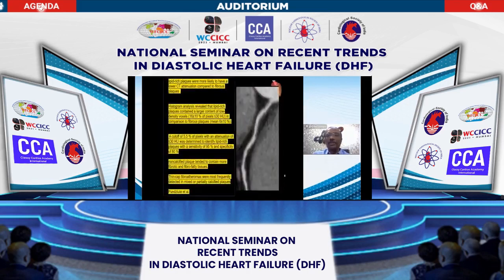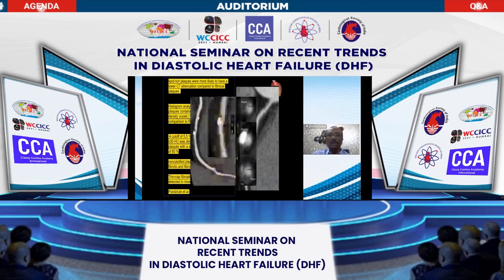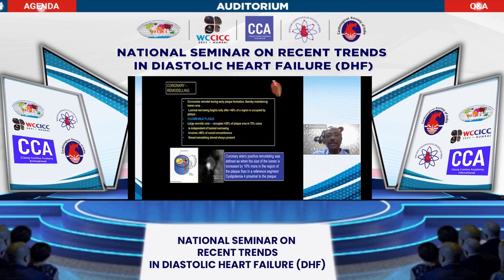So this is one clinical example where we have done a curved planar reformat showing mild to moderate disease of the entire right coronary artery. When you measure the low attenuation plaque burden, more than 70% of this vessel has a non-stenotic low attenuation plaque with a vulnerable morphology. So this patient, even in the absence of a clinical symptom, will fall under the category of a vulnerable vessel with a vulnerable plaque. Again, an example of a non-stenotic lesion with a spotty calcium is seen.